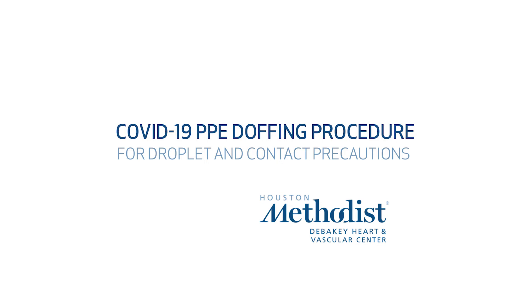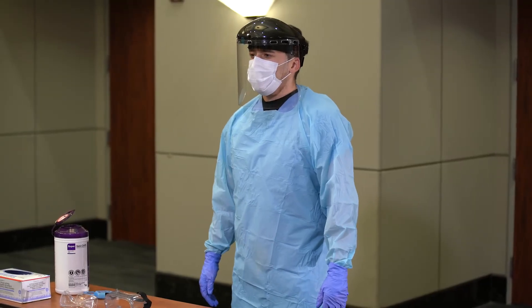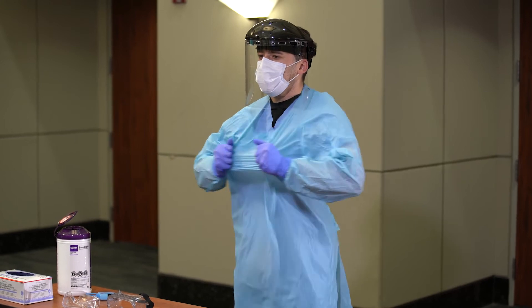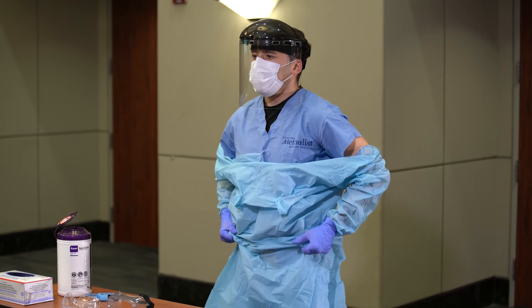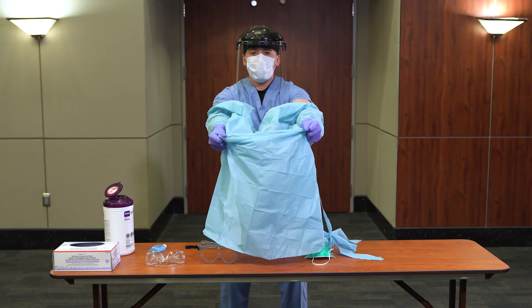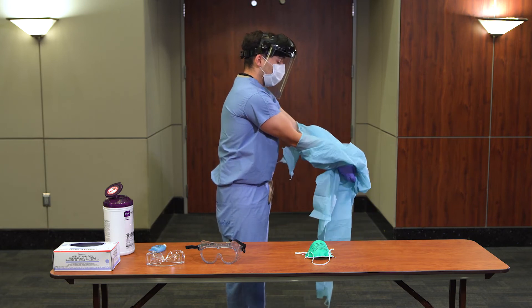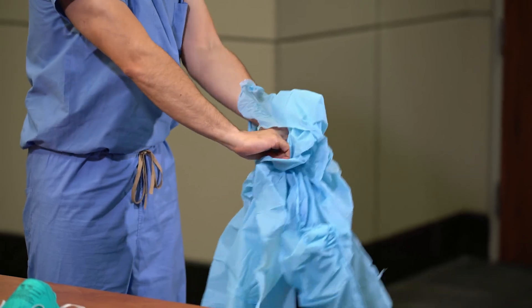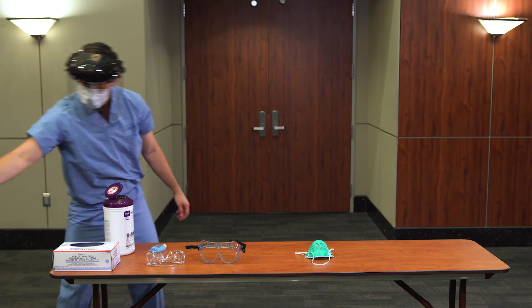Transmission-based precautions must be applied in conjunction with standard precautions. The following procedure will be used for doffing PPE for droplet and contact precautions. Doff isolation gown and gloves by first grabbing the isolation gown at the chest and pulling forward. Grab isolation gown at the waist and pull forward. As you are removing the gown, peel off your gloves at the same time, only touching the inside of the gloves and the inside of the gown with your bare hands. Place the gown and gloves into a waste container. Perform hand hygiene.